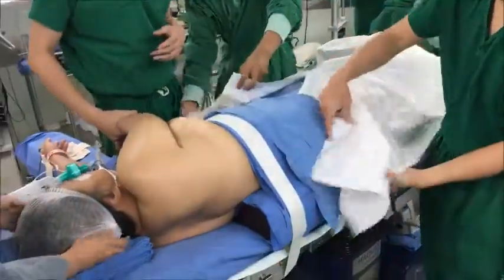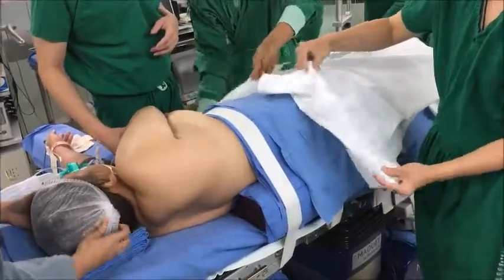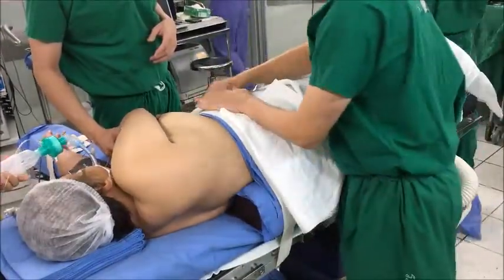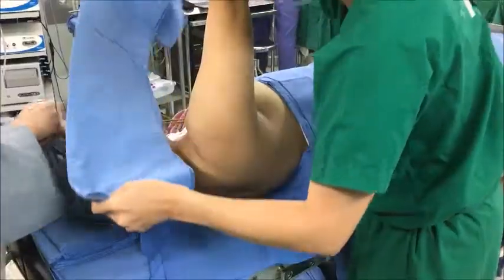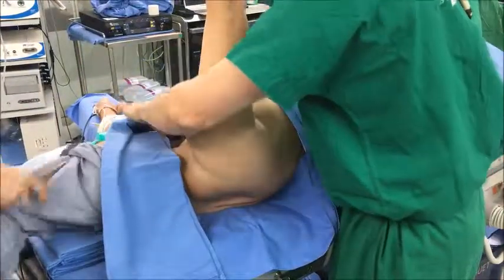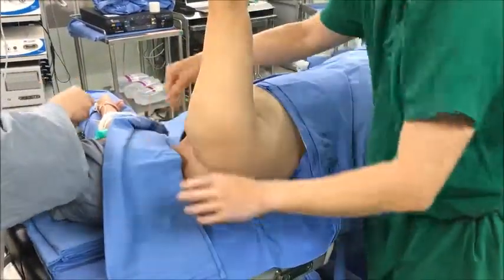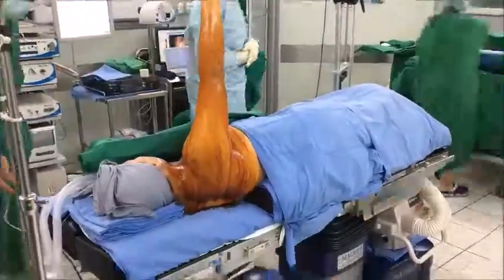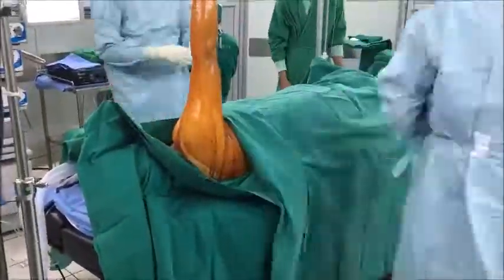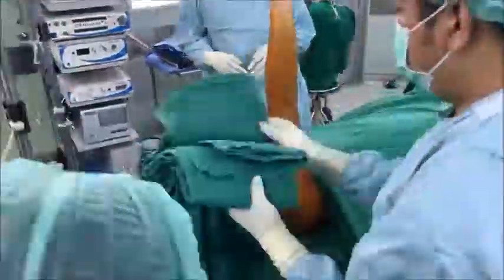The patient is covered with a warm sheet to prevent hypothermia. The shoulder is prepped and draped in a sterile fashion. The arm, forearm, trunk, and head are covered with a sterile sheet.